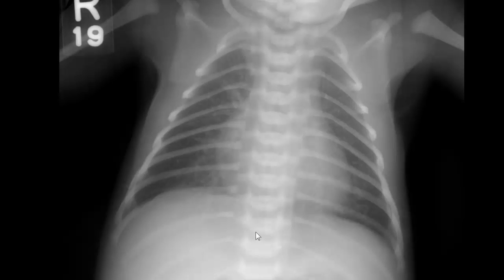Neonatal pneumonia can pretty much look like almost anything. The most classic appearance is similar to hyaline membrane disease. If you ever see a newborn that looks like hyaline membrane disease but has pleural effusions, they probably have neonatal pneumonia.